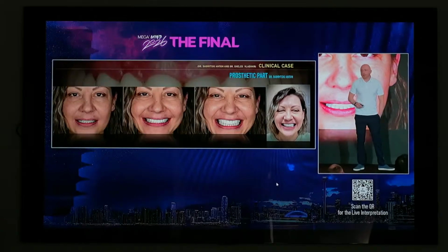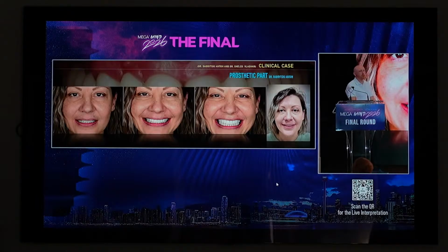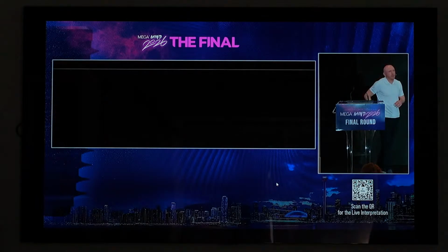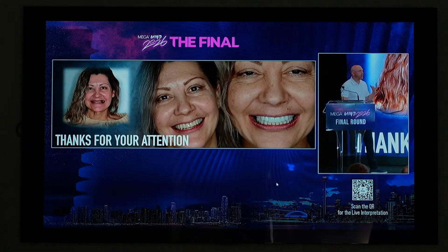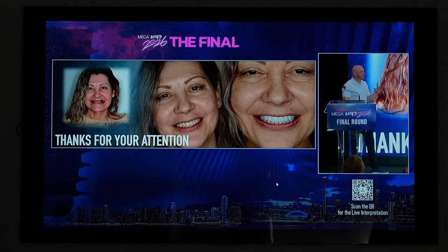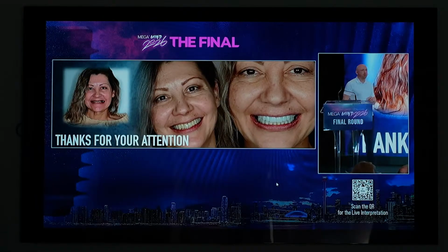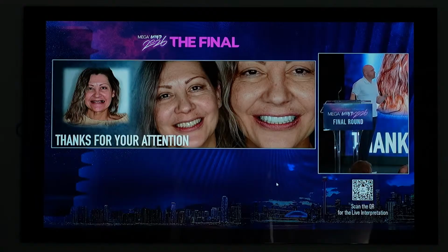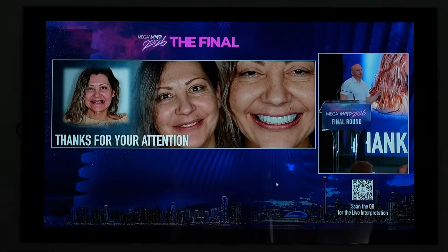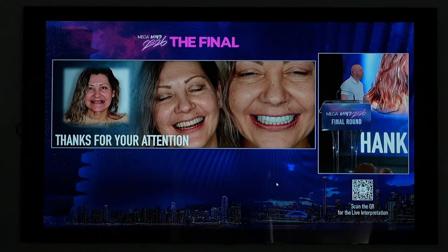And we advise our patients with such constructions, with full mouth restoration, to have professional hygiene every 6 months, and to remove this construction every 2 years for laboratory cleaning of our bridges and for professional hygiene around the implants and around the multi-unit abutments, and to use new fixation screws, Megagen screws, replacing them every 2 years from our point of view.